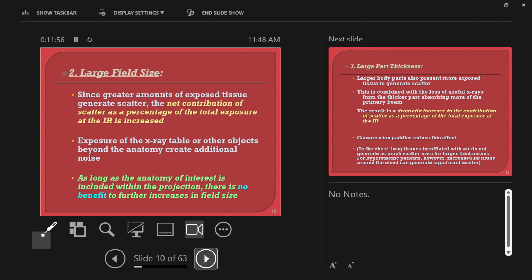It's just a light bulb. There's usually a little bracket right on the back. Take it off, replace the light bulb. It could not be easier. So you want to know which light bulbs they are and how to find them, and they're not cheap. They are kind of expensive. They are usually light bulbs that are used in projectors. So projector light bulbs can be kind of expensive. Anyways, that's something to think about.